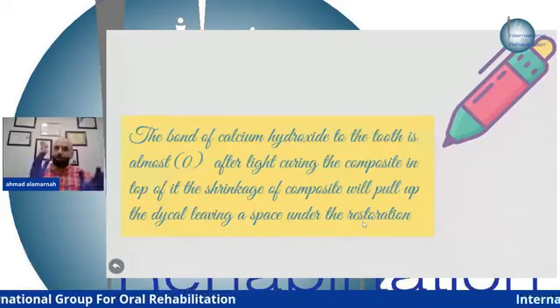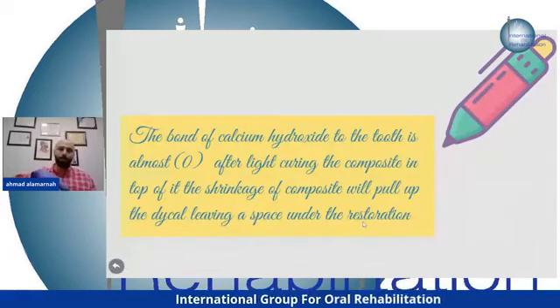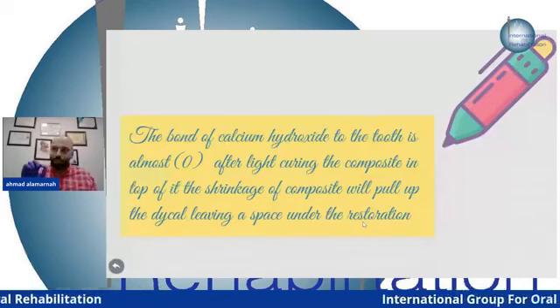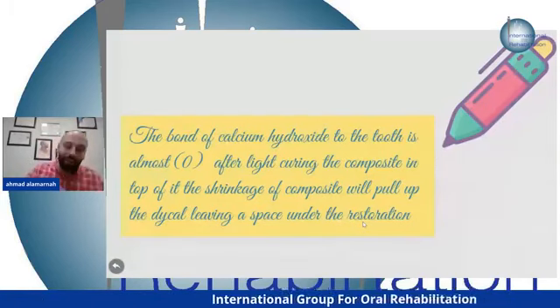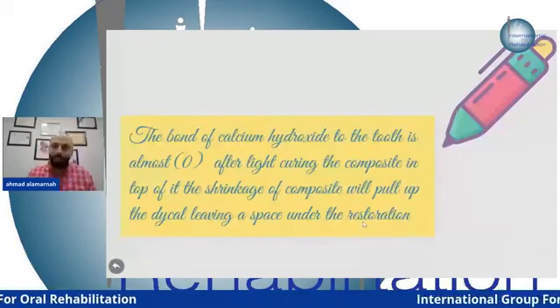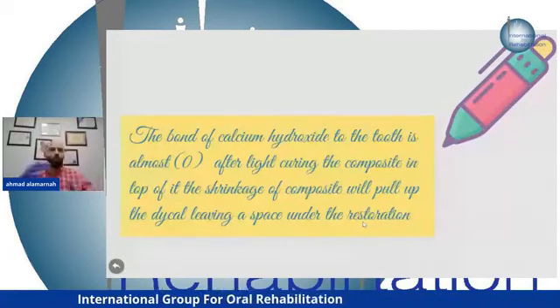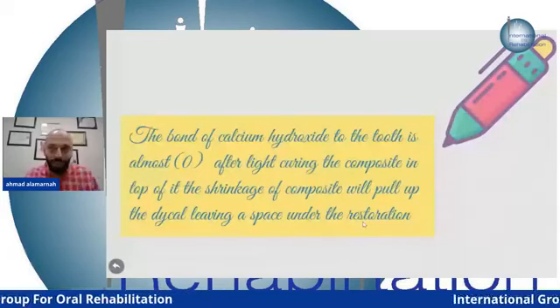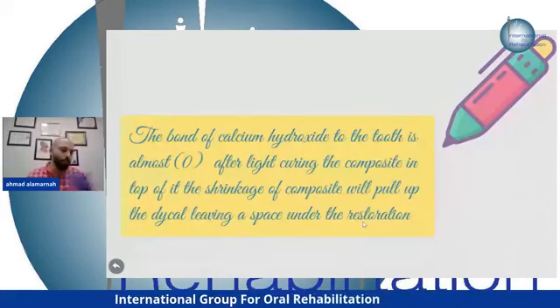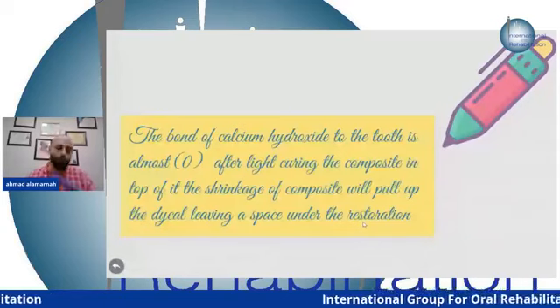So when you place your Dycal and it's good, it's in its place, and you do your composite restoration, the composite itself will shrink a little bit. This shrinkage will pull the Dycal away from the area where you placed it and create some space. This space will cause differential pressure and some pain during mastication, and later on it will go to necrosis. I don't say all the time, but most of the time.